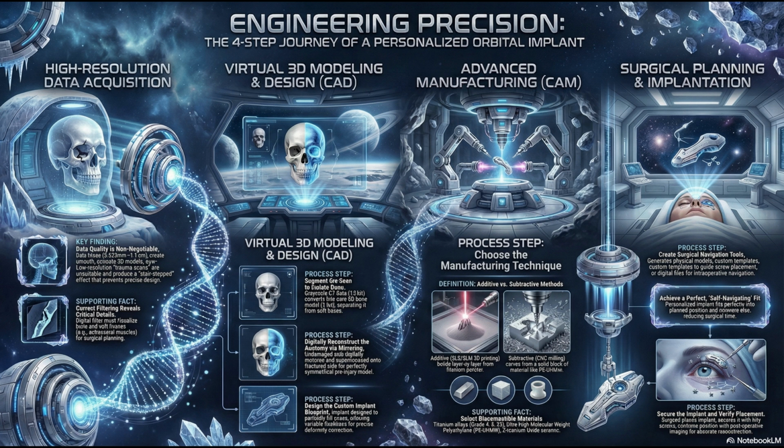This is for the really tough cases, the late reconstructions, the ones with a lot of scarring. That's when you need intraoperative navigation. And that requires a whole other layer of digital work, well beyond the initial scan. Exactly. We're not just talking about getting a good image anymore. The CAD designer now has to build a mechanical connector, a little mounting point, directly onto the implant itself so it can be attached to the navigation probe.